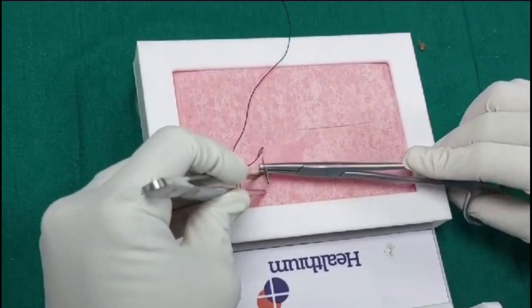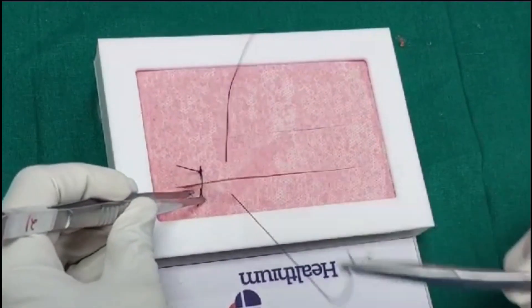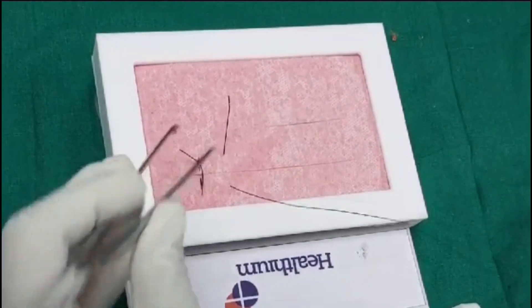This completes far-far component. Then near-near component will be vertically oriented to the far-far component.